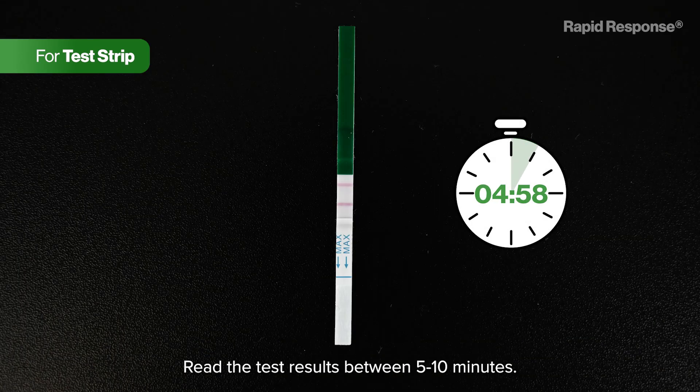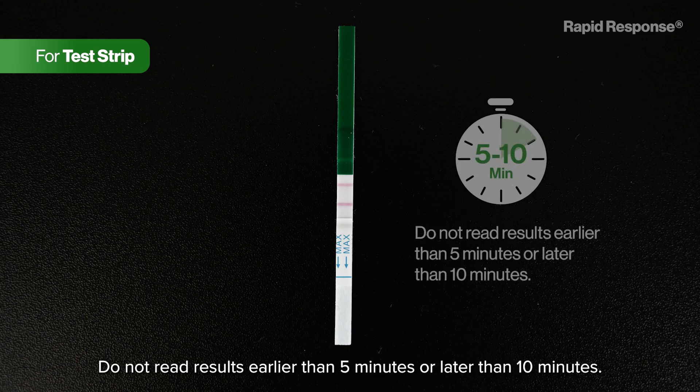Read the test results between five to ten minutes. Do not read results earlier than five minutes or later than ten minutes.